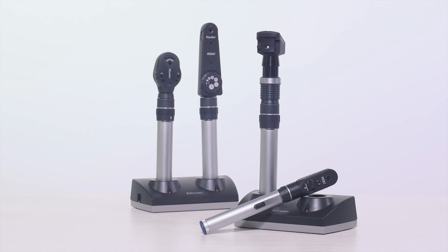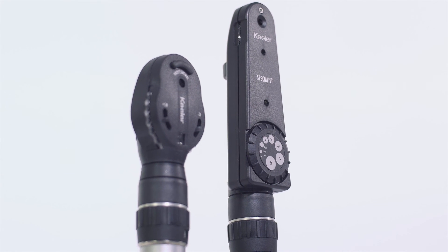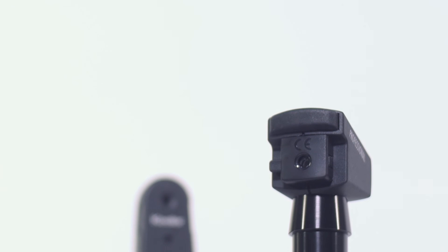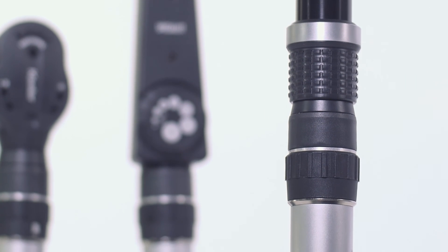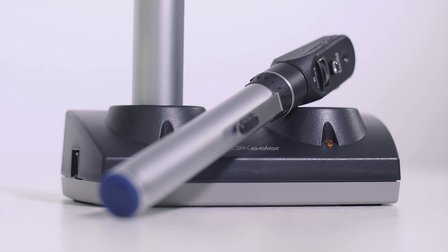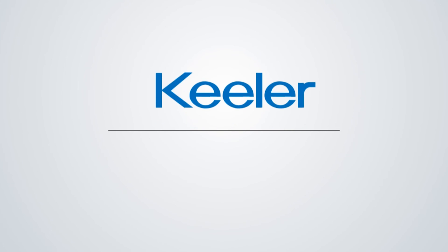Keillor handheld diagnostic tools are light, comfortable, and built to last. Our renowned optical system offers the best focus and clearest view. The Keillor customer service team is dedicated to helping in any way they can, so please visit the website or give them a call.